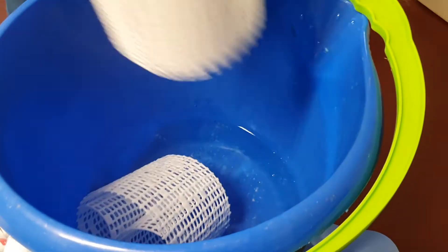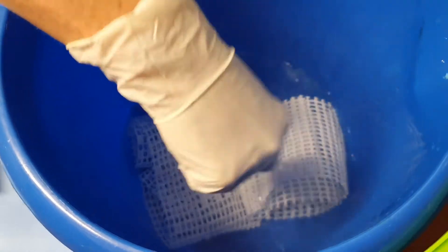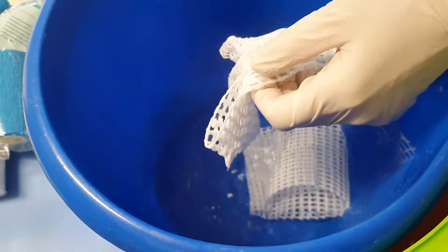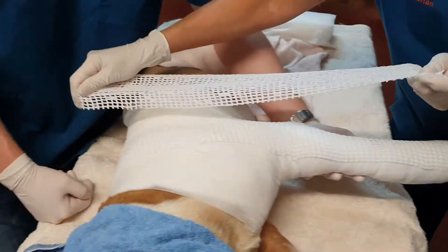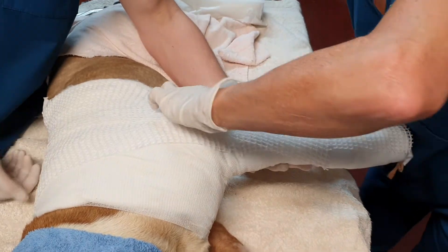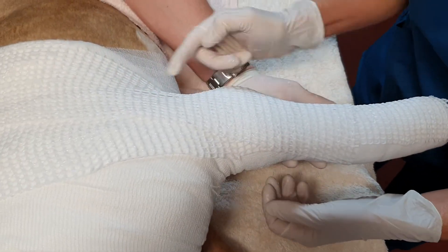I'm going to put the third layer in there as well. Definitely needs to be boiling water fresh out of the kettle — as soon as it loses temperature you don't get that nice soft malleable splint material. Here we come, and we want to fan this out at the top. It doesn't want to be over top of the padding, just near the padding, moulding it around the elbow region. That would ideally come all the way down the leg.